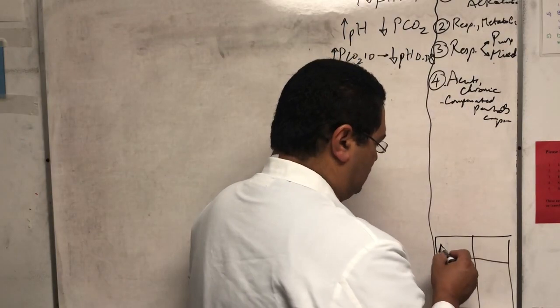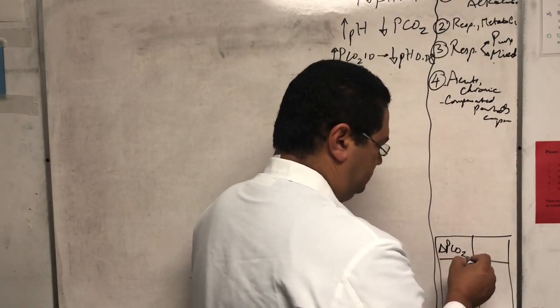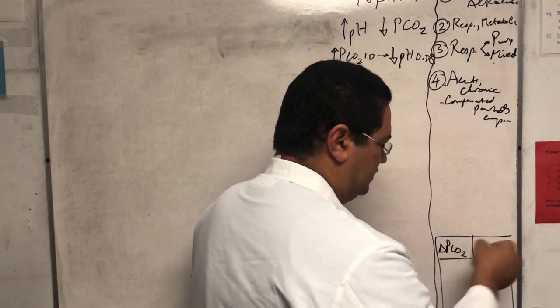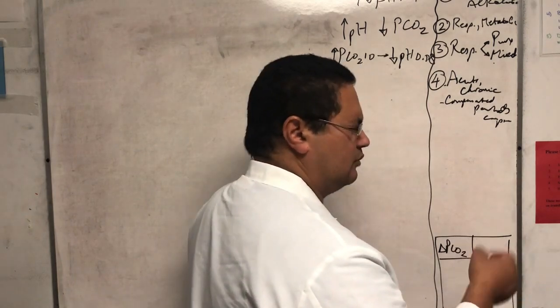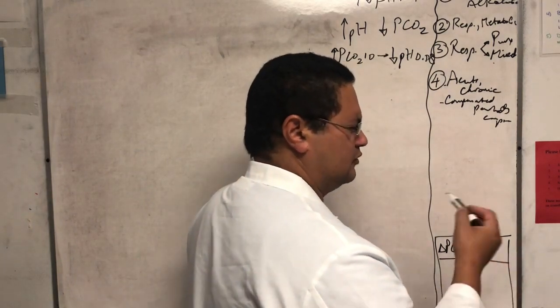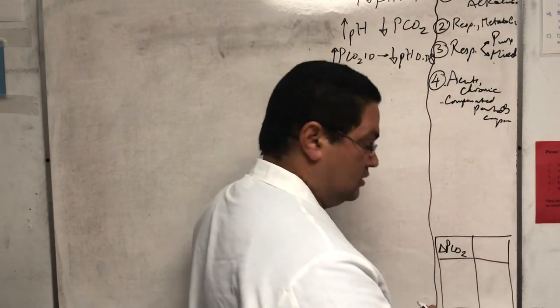This is a change of the PCO2, so we're talking about respiratory issues. This table is trying to find what is the metabolic compensation expected for different respiratory disorders.